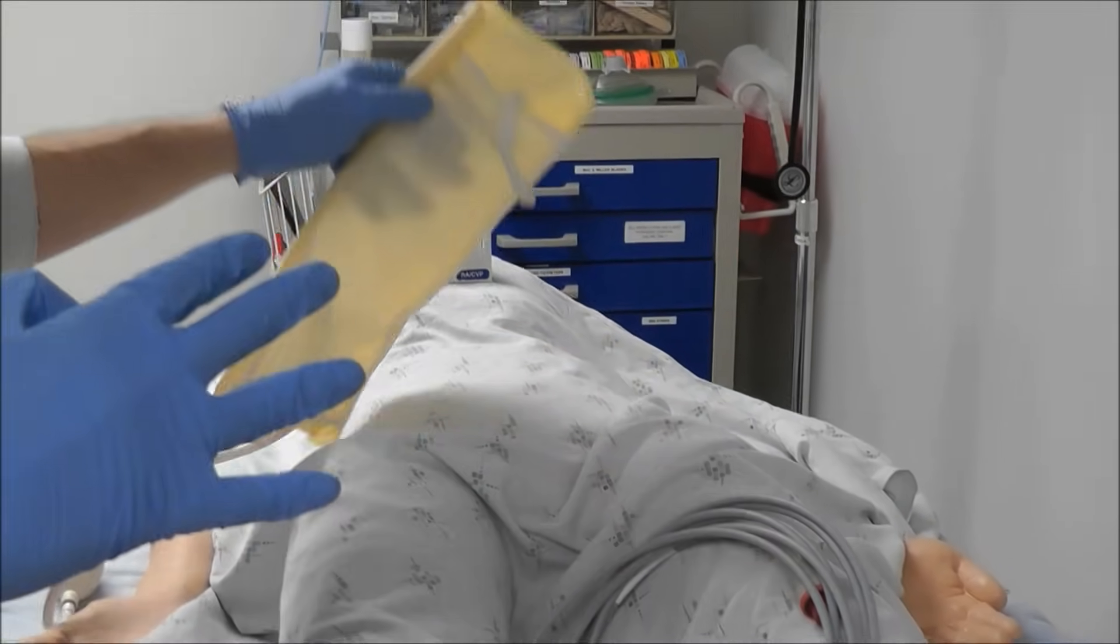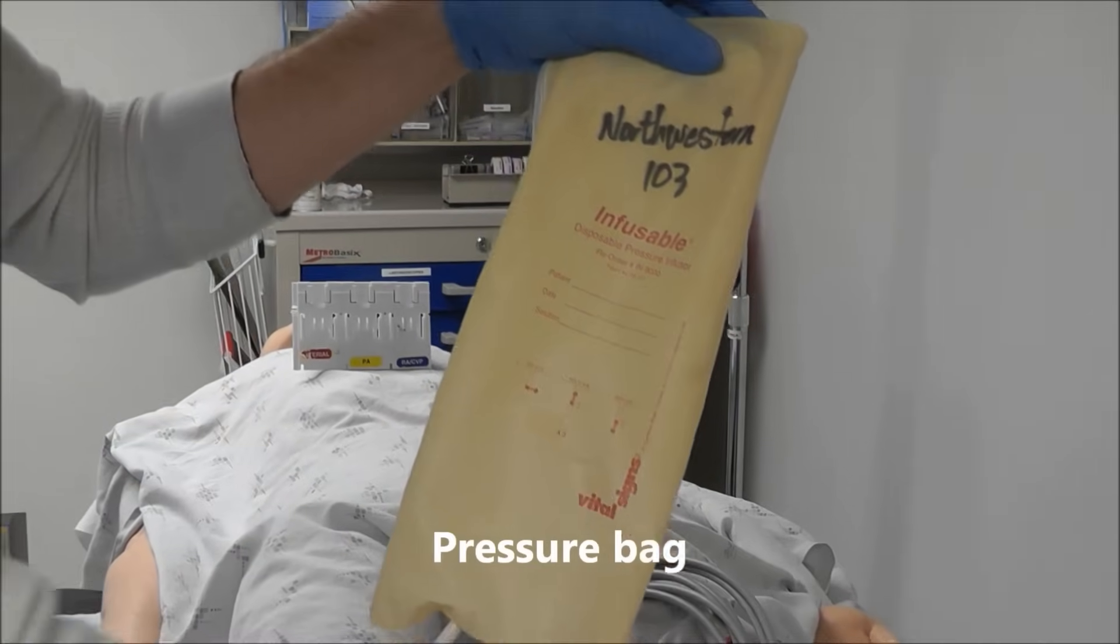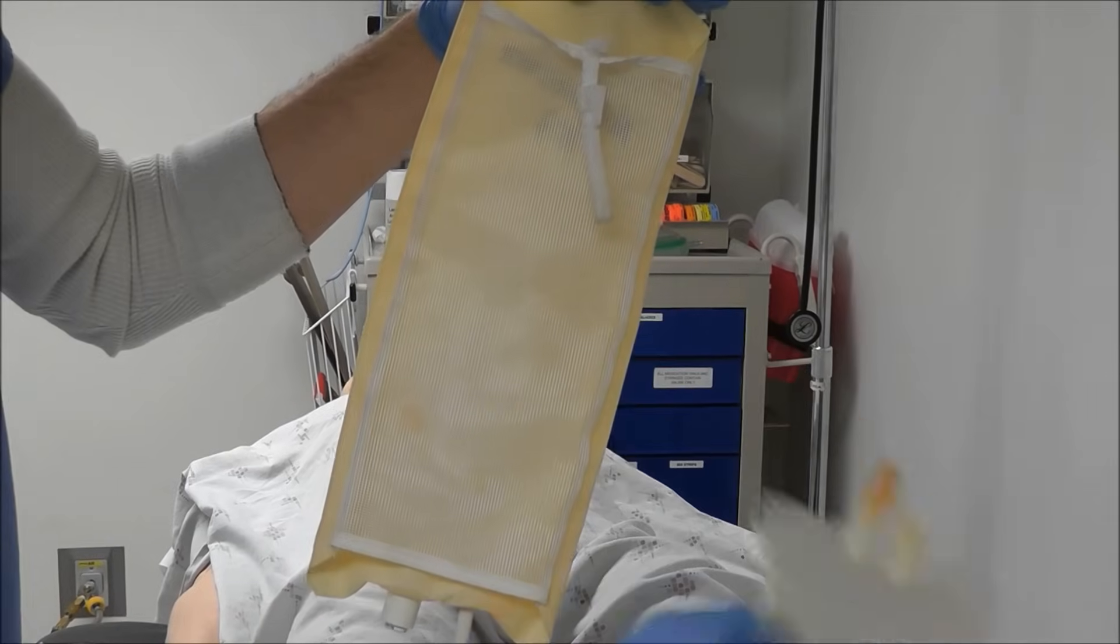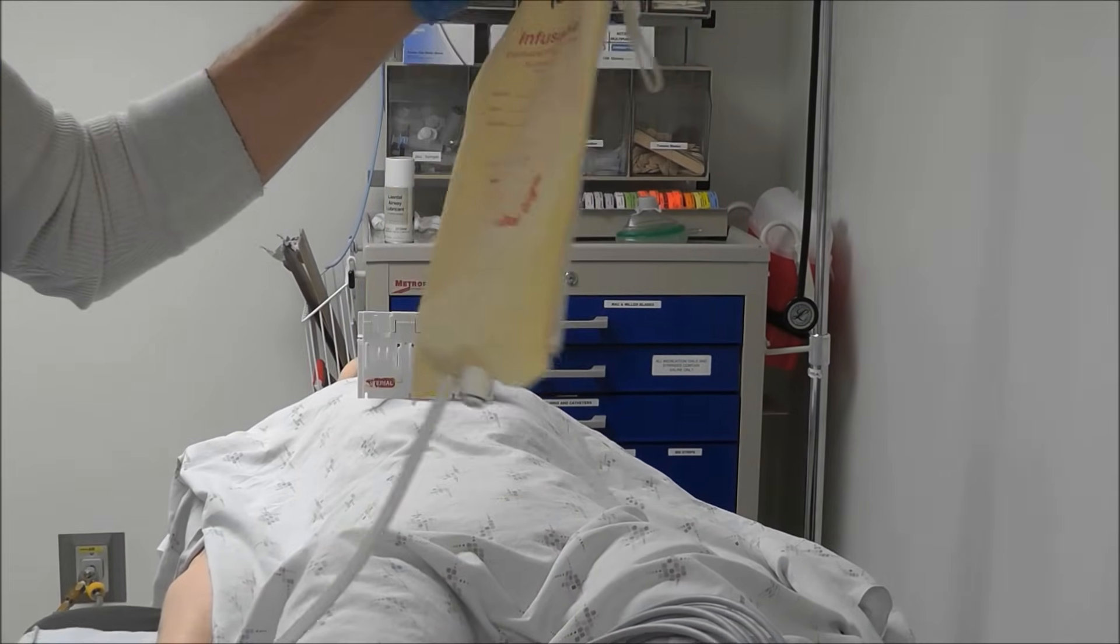The fourth thing that you're going to need is a pressure bag that will be able to pressurize the saline so we can put this system under high pressure so we can flush the tubing.